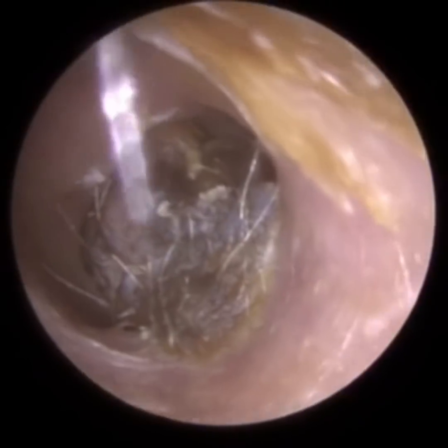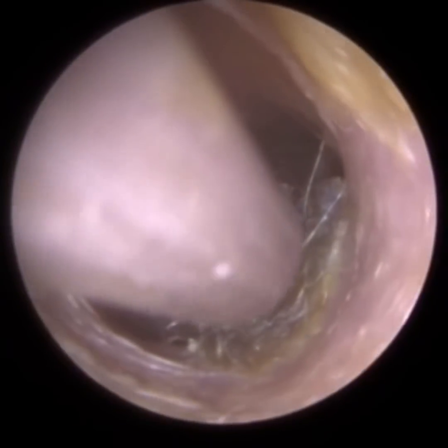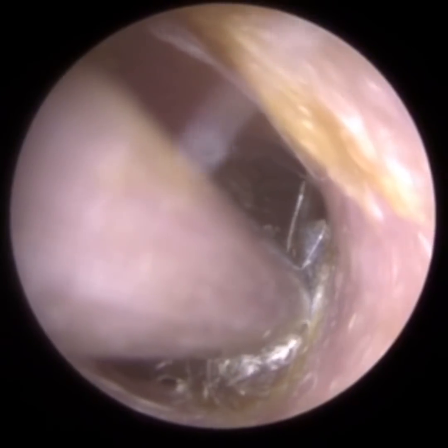This video is a compilation of three procedures which all primarily use mechanical instruments to remove the wax. When we say mechanical instruments, we mean non-suction and non-irrigation, so no water.